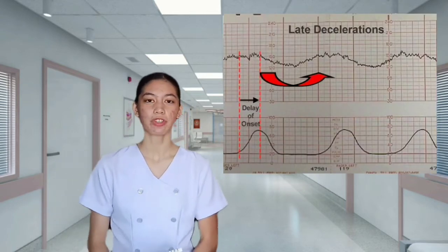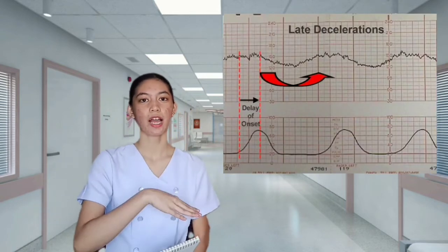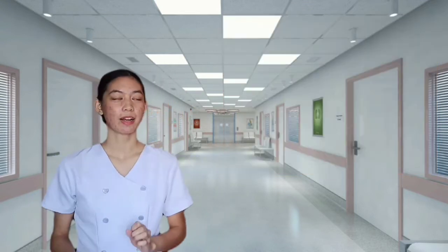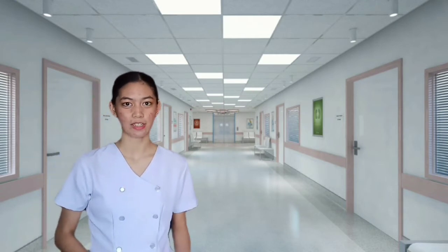Late deceleration is delayed in timing. Nag-occur siya after peak contraction ni mother. Nauuna ang contraction ni mother bago yung onset ng fetal heart rate deceleration. Ang late deceleration ay nag-indicate ng fetal hypoxia, and it also represents uteroplacental insufficiency.